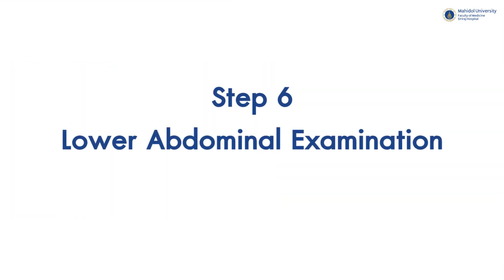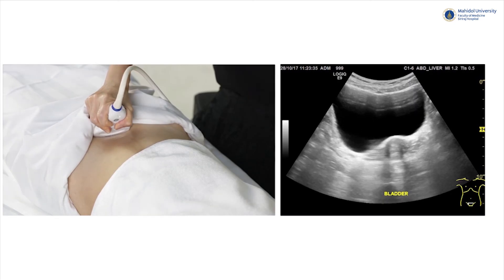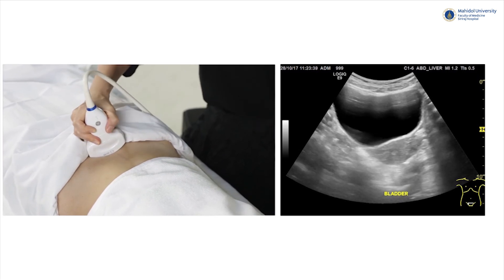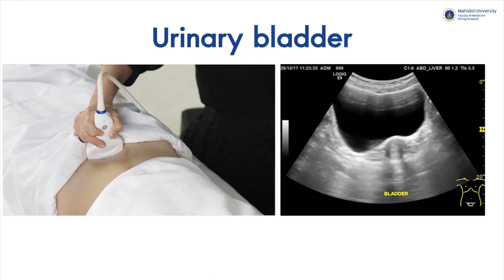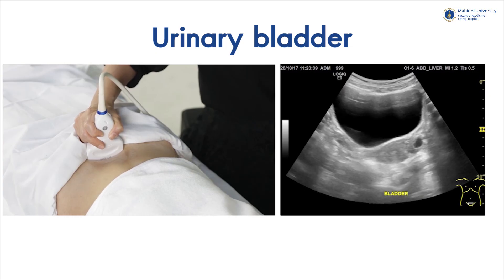Step 6: Lower abdominal examination. With full bladder preparation, we can see the pelvic organs behind the bladder more clearly. In a poorly distended bladder, there could be bowel gas superimposition. A normal urinary bladder will show a smooth and thin wall, which we should scan in both axial and longitudinal planes.